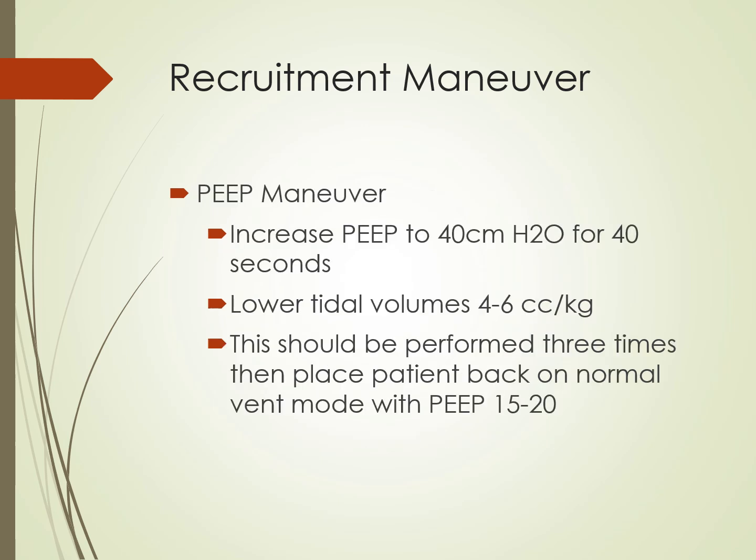This is the third maneuver, and it's actually called the PEEP maneuver. Basically, you increase PEEP to 40 centimeters of pressure, and you keep that PEEP on for 40 seconds.